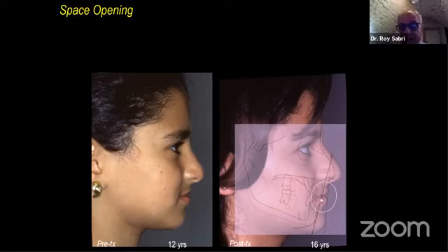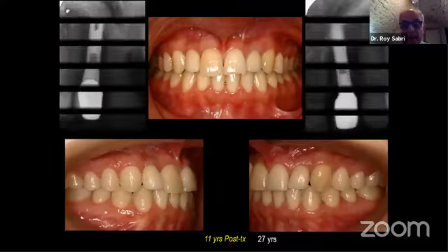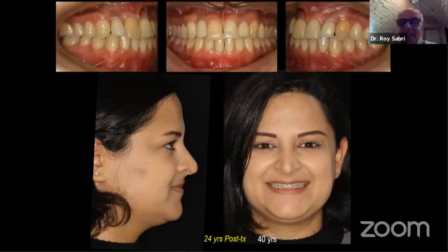There is a good lip support. And here is her end result from a frontal view. And I published her in the Arab Dental Journal. And I had the chance to see her after that, 11 years post-treatment. And you can see the nice outcome as far as gingival level. And I saw her also 24 years post-treatment at age 40. And you see that it's a nice outcome.